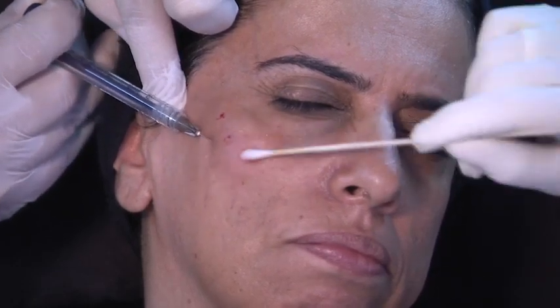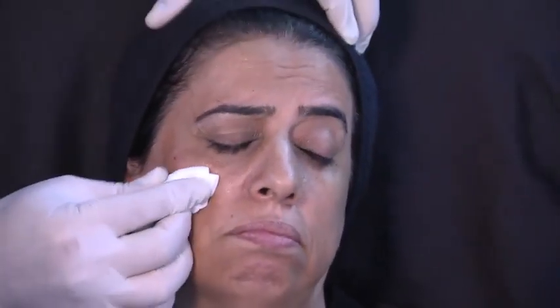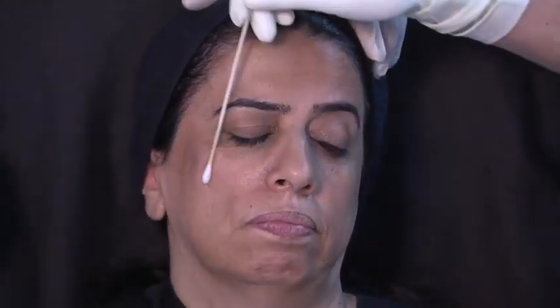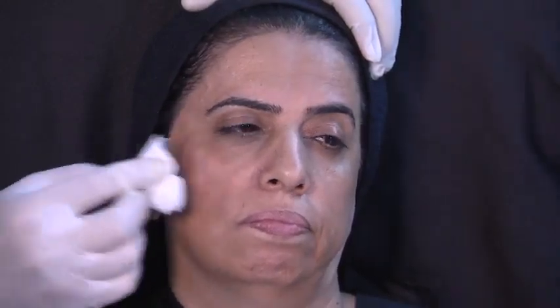Finally, I want a little smoother transition. So what I'm going to do is under this area, I'm going to go to deep dermis and I'm going to go in this area to create a smoother transition. Okay? Frank, could you mark in different colors the placement of bone and then the superficial pad or deep fat pads, what Juan is trying to achieve here?